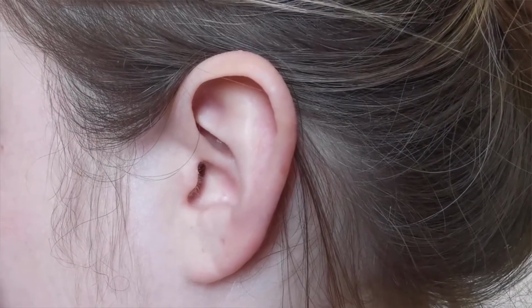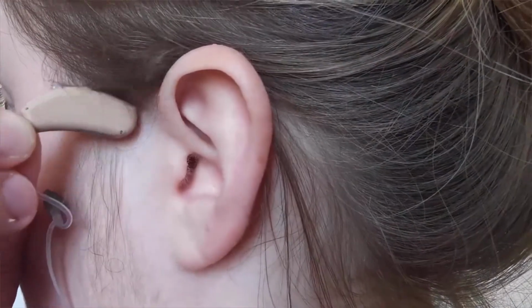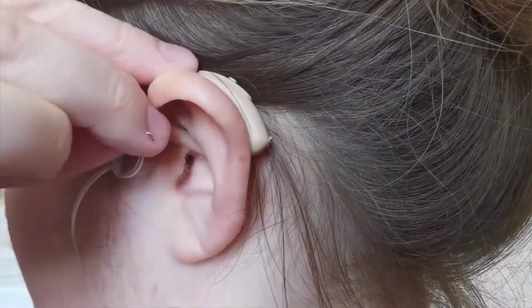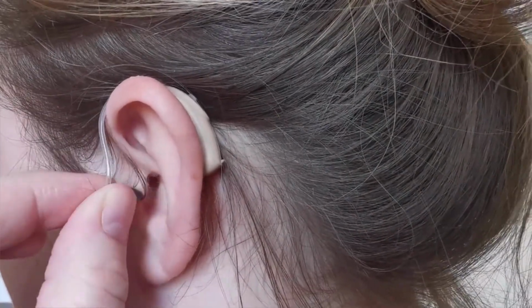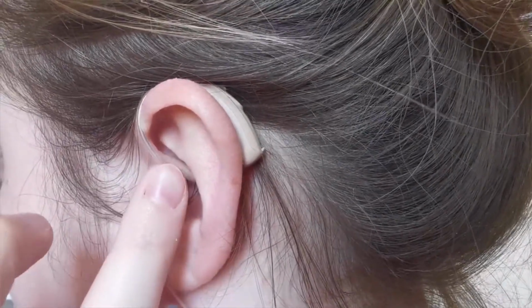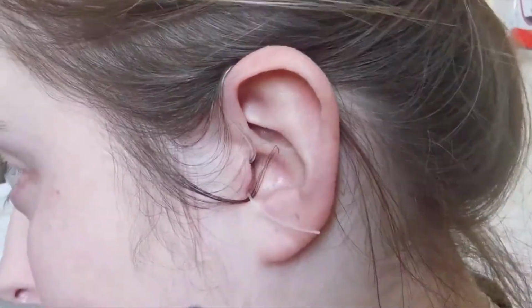In this video, we will show you how to insert the hearing aid. First of all, you need to sit the hearing aid at the top and behind your ear. You then guide the dome into your ear canal. You then push the tubing so the dome sits further into your ear canal.